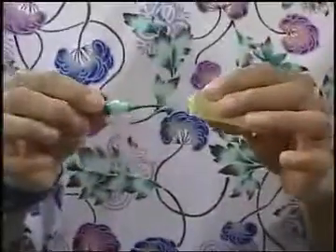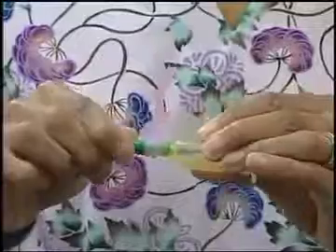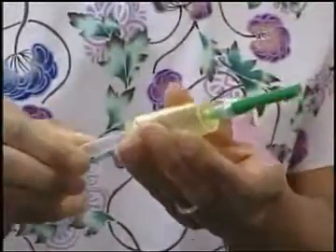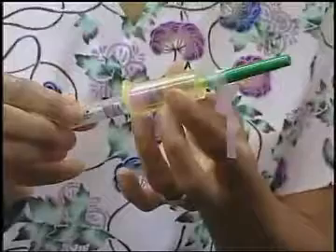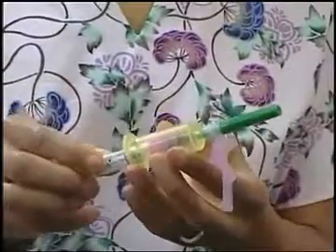Once you're ready to begin, you're going to screw the needle into the plastic holder. Insert the tube into the other end of the holder. The top of the color stopper should reach the thin guide on the holder. Don't press the tube. If your tube exceeds the thin line, throw it away because it may not have a vacuum.